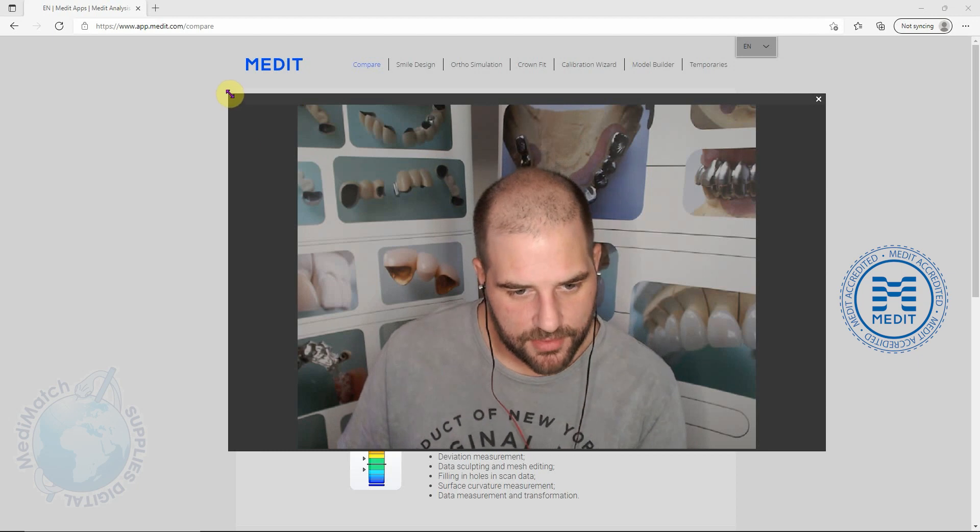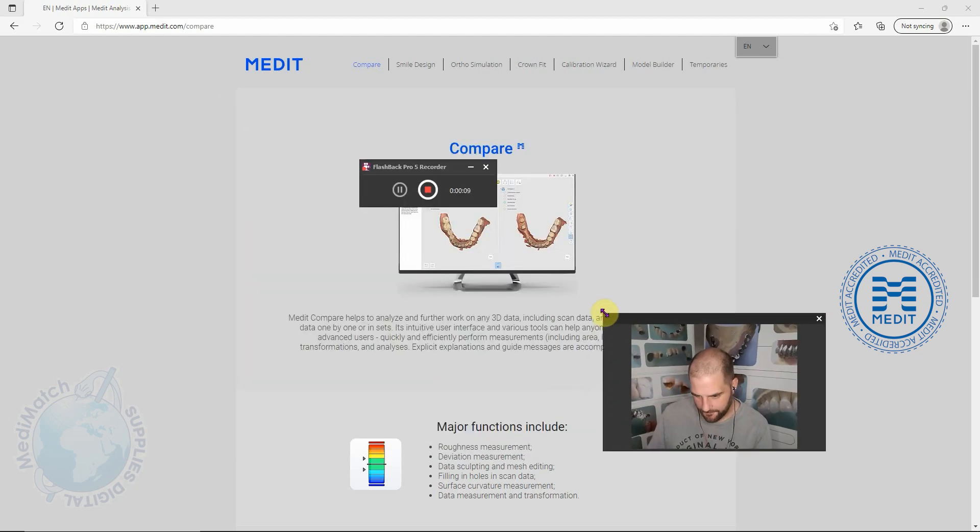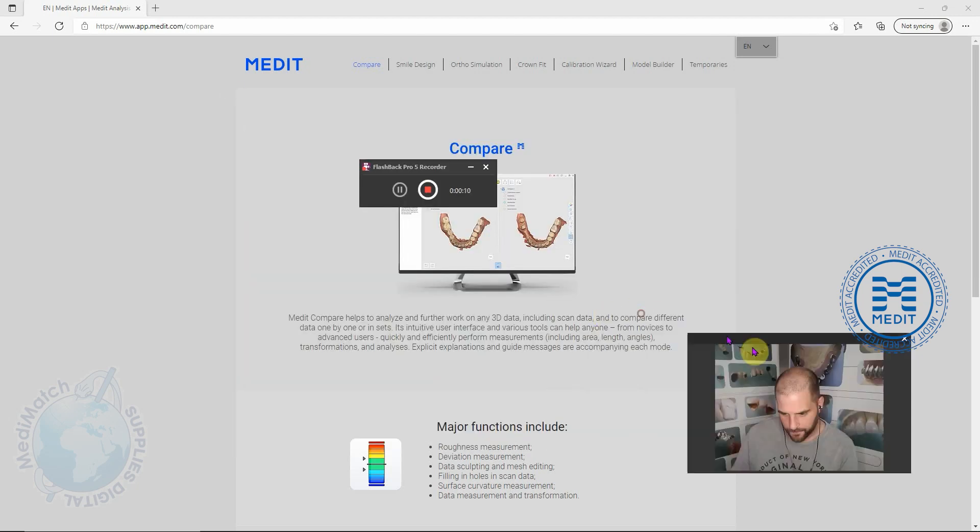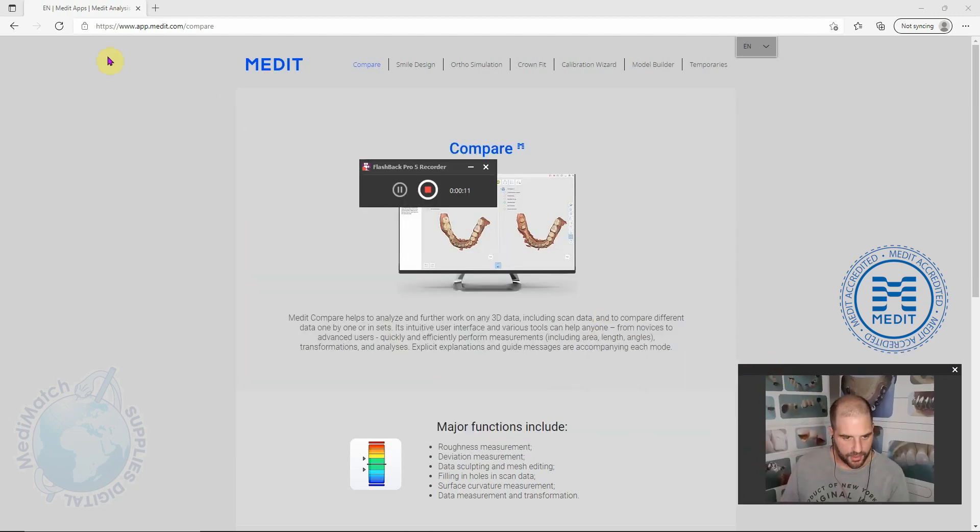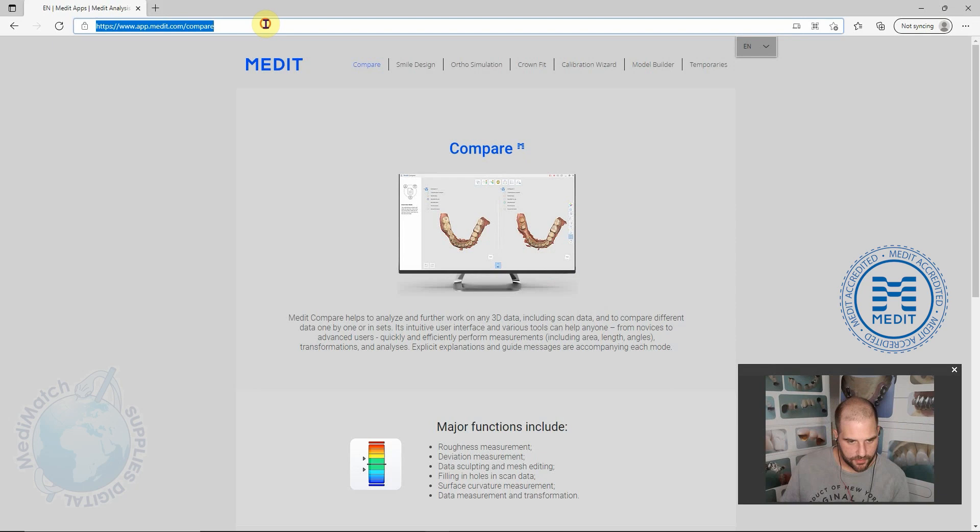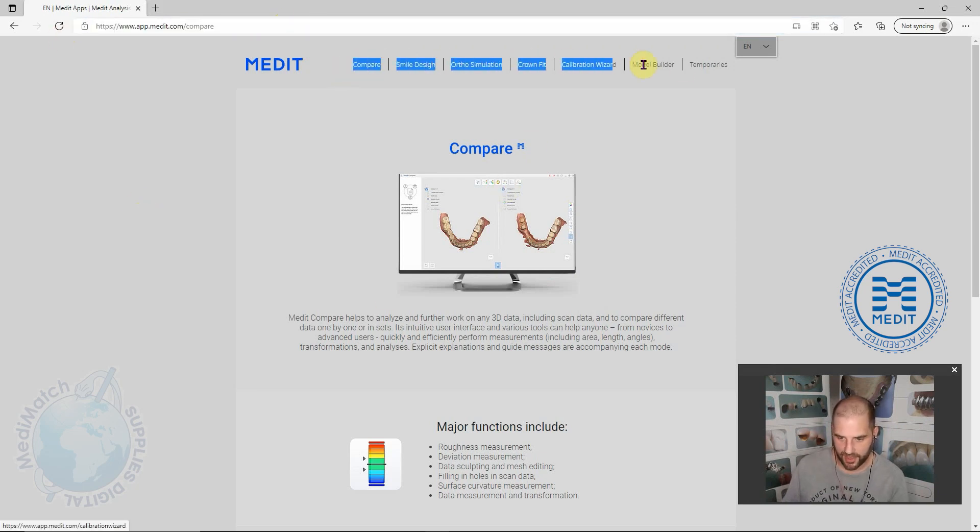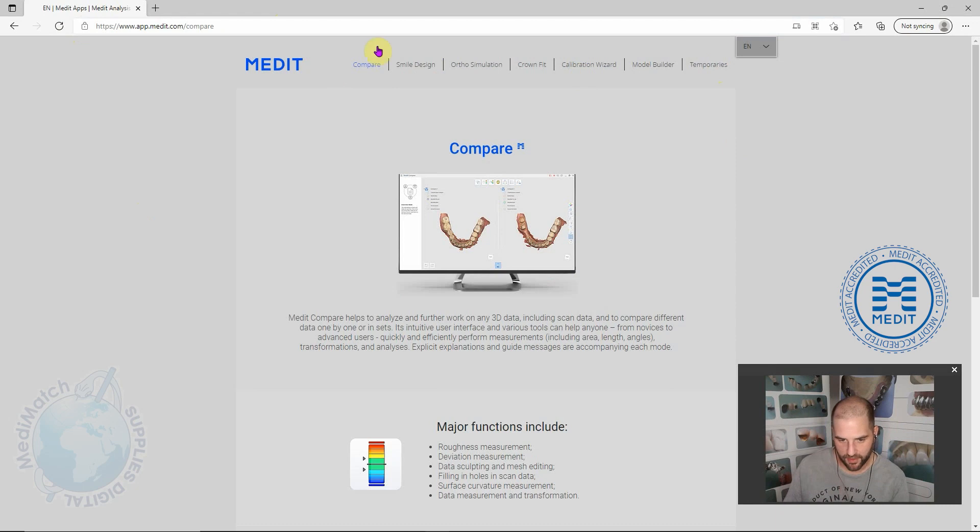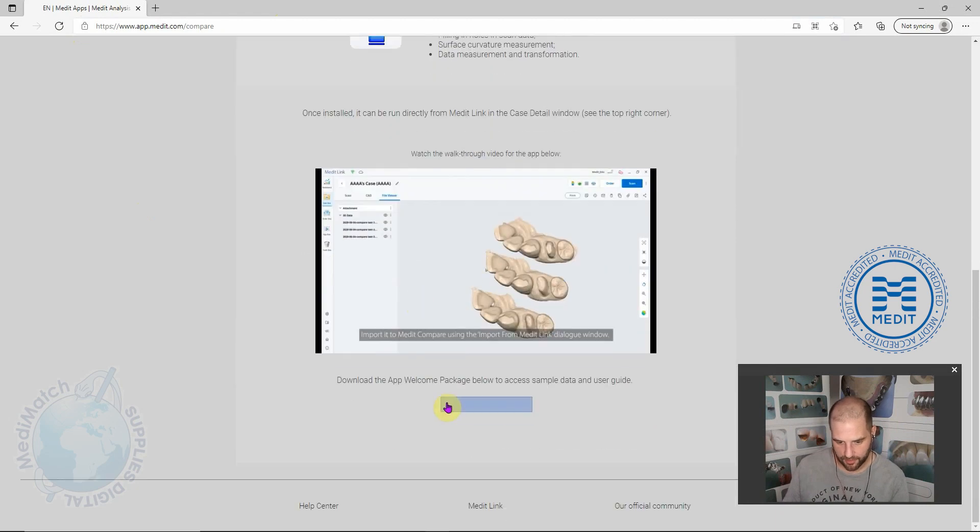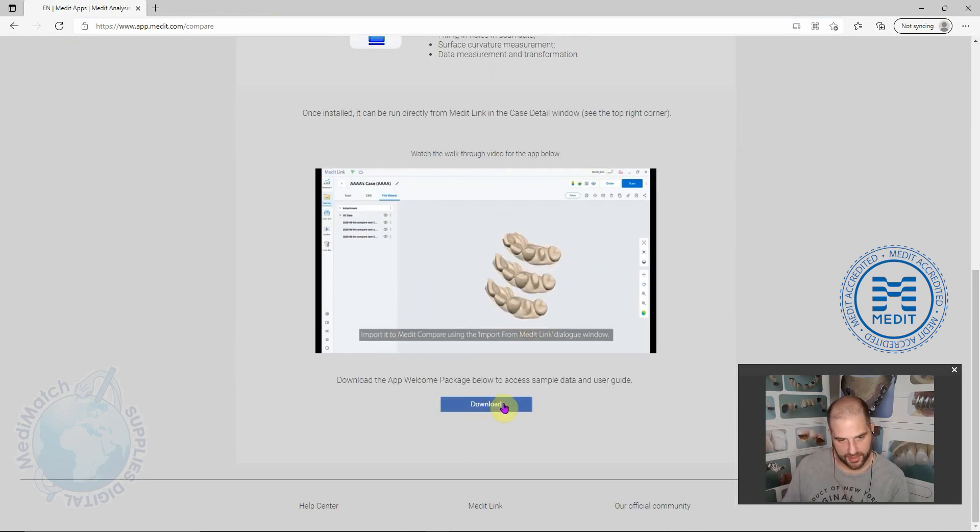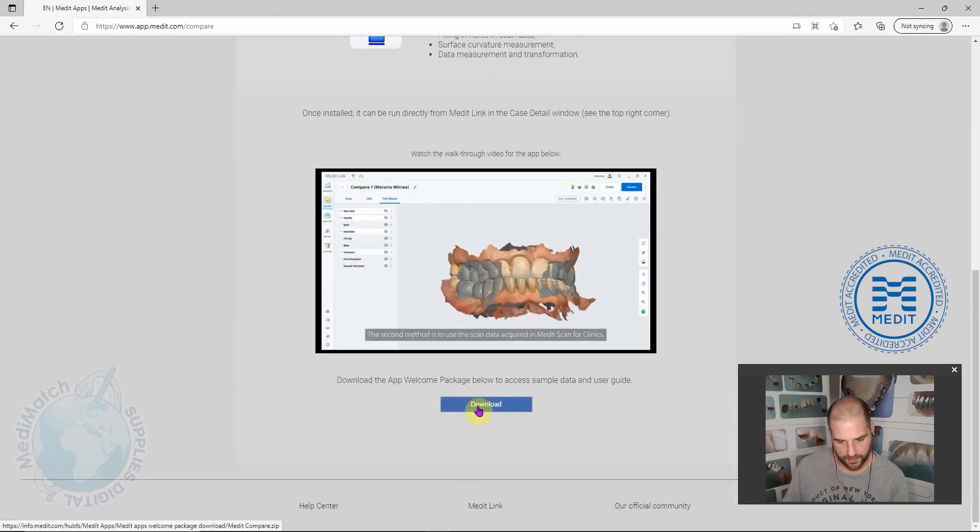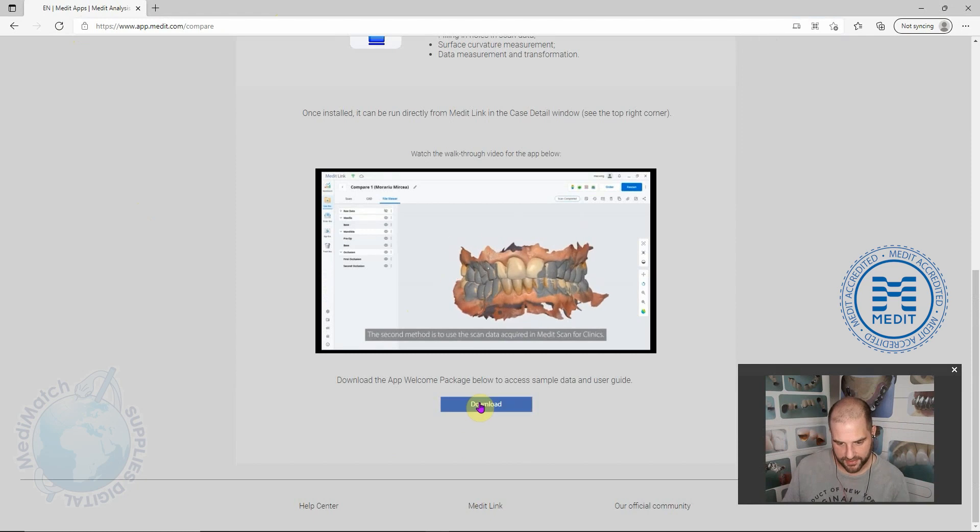In this short video we're going to take a quick look at the Medic Compare app. Let me make myself a bit smaller here. If you go to this web address it will bring you to this page where you've got the various apps across the top and you can click on any of them. If you click on the Compare one, down at the bottom you can download some sample data here. If you want to play around with the same data that I'm using you can do that.